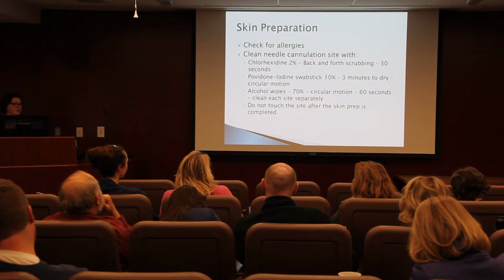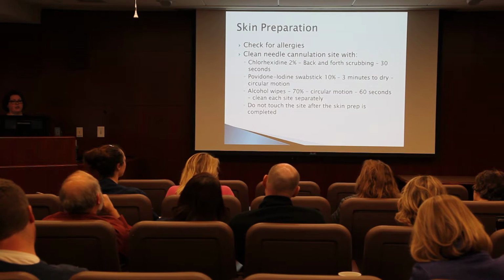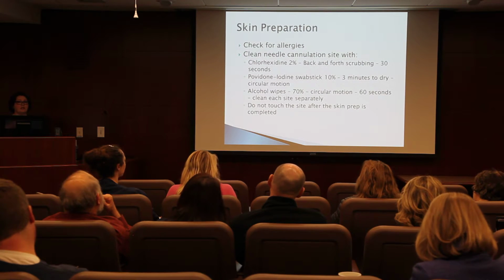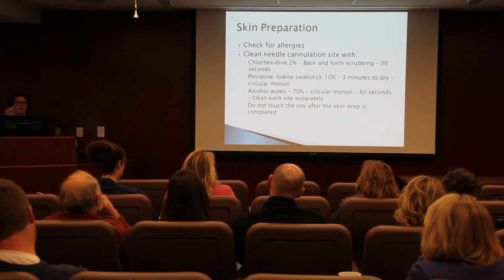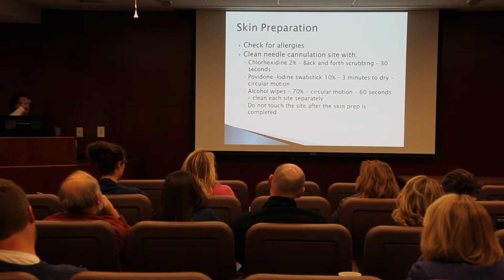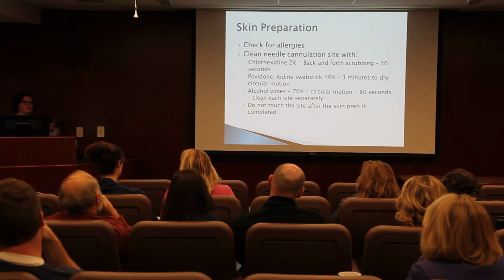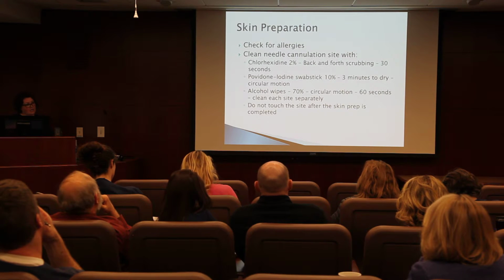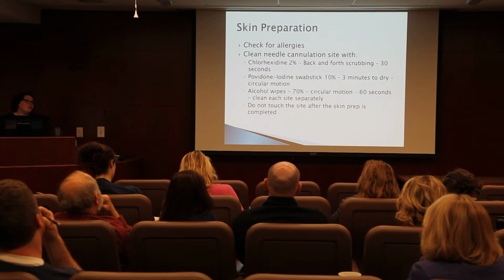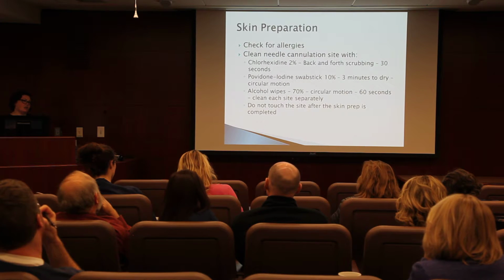And then the skin preparation. Like I said previously, you want them to make sure and use soap and water before coming into your unit. Chlorhexidine, back and forth scrubbing for 30 seconds. The iodine or the povidone, make sure you don't go over the same area twice in a circular motion, and then let it dry for 3 minutes, because that's when it's killing all of the germs. Alcohol wipes, 60 seconds. Then don't touch the skin after you've prepped it. Sometimes people want to go back just to make sure, but if you do touch the skin, wipe it off again.